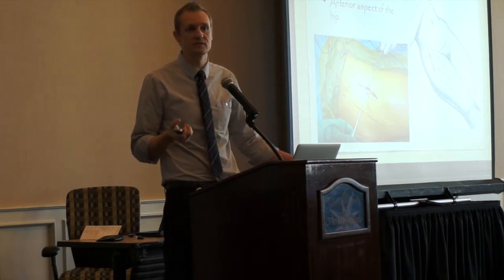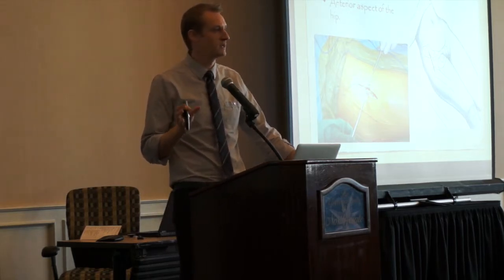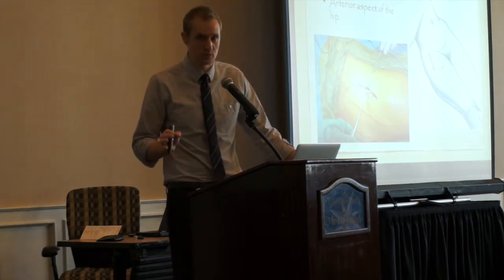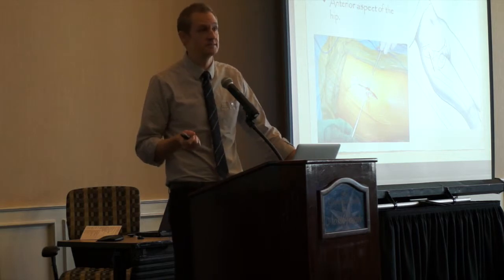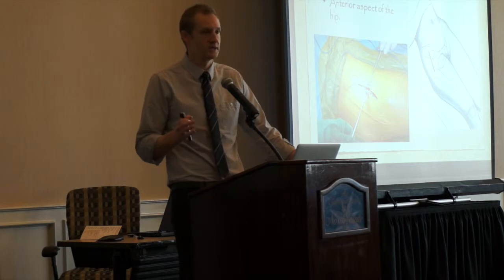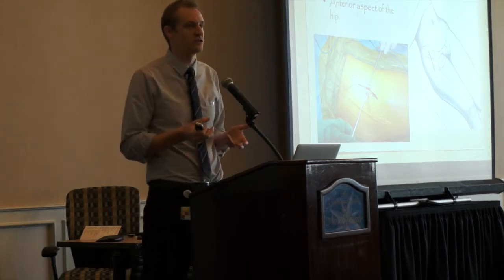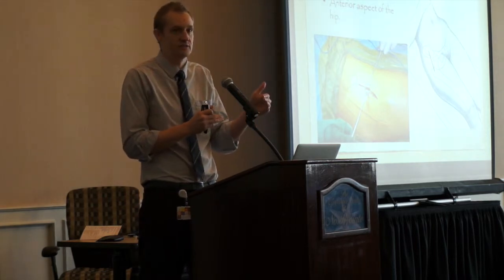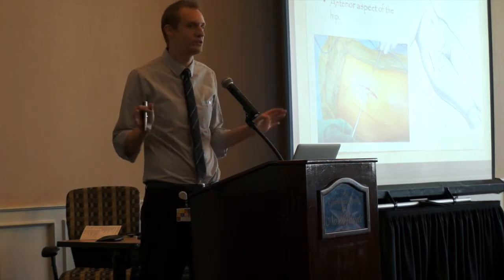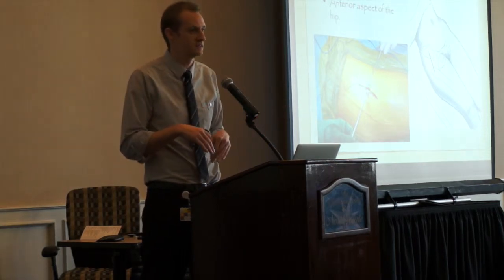The incision is relatively small, 10 centimeters, around 4 inches. I don't want anybody to get caught up on the size of the surgical incision. It's not important. Patients like it. Patients think it's kind of amazing you can put a hip through a very small incision, but it really doesn't matter. Some of the opponents of minimally invasive surgery get hung up on incision length. That's what defines a minimally invasive surgery, and it really shouldn't matter whatsoever. What's important is what happens underneath the skin incision.